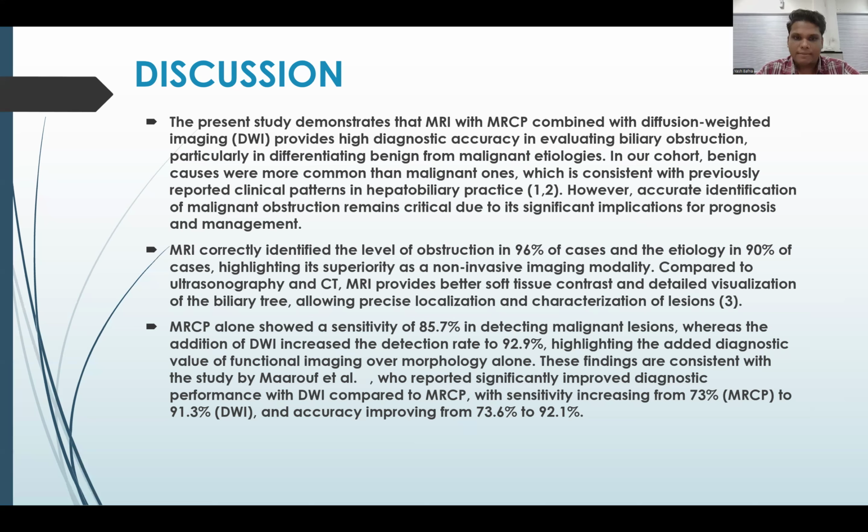MRCP alone had a sensitivity of 85.7% in detecting malignant lesions, whereas the addition of DWI increased the detection rate to 92.9%, highlighting the added diagnostic value of functional imaging over morphology alone. These findings are consistent with previous studies.